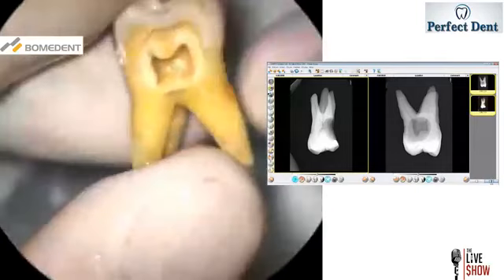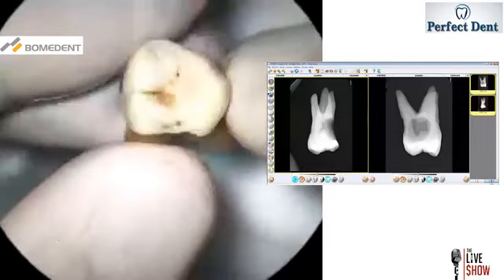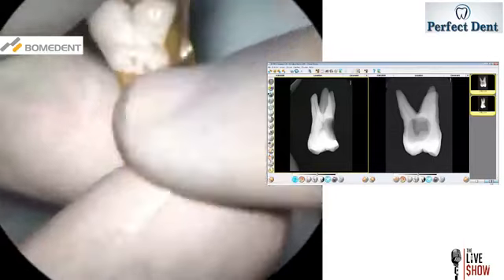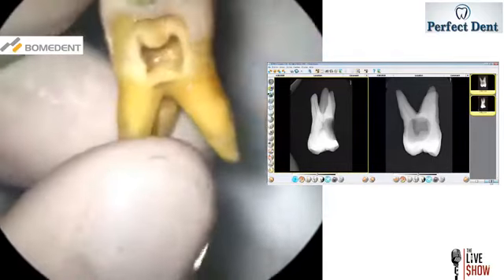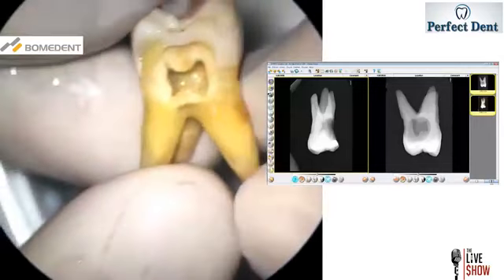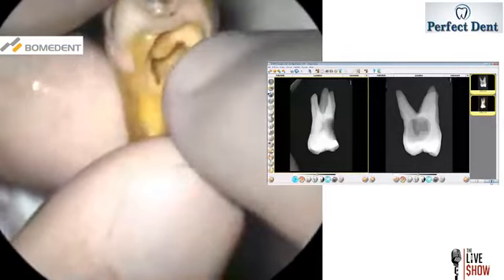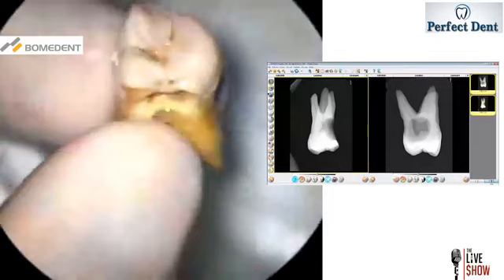Here is a question, Doctor. Is it a restorable tooth? Obviously, this is not restorable. It's maybe 4 millimeters under the cervical margin. So it's not really restorable, but that's why it's extracted. That's why it's in my hand, not in the patient's mouth. But it is very useful for the purpose of my treatment today to show you a case with an access from the side so you can view what's happening during the access cavity preparation.